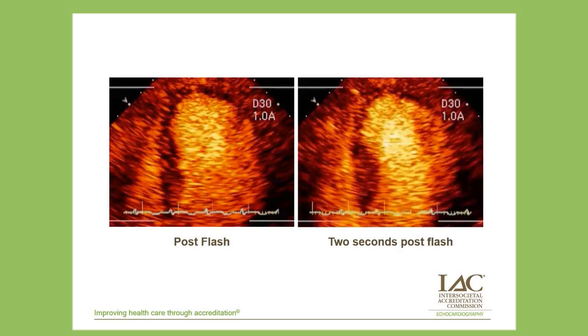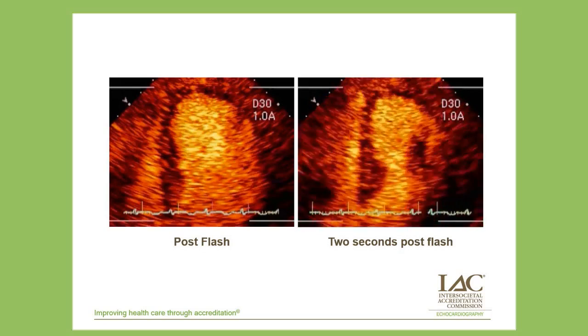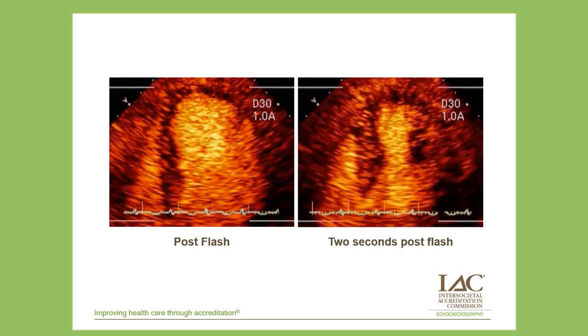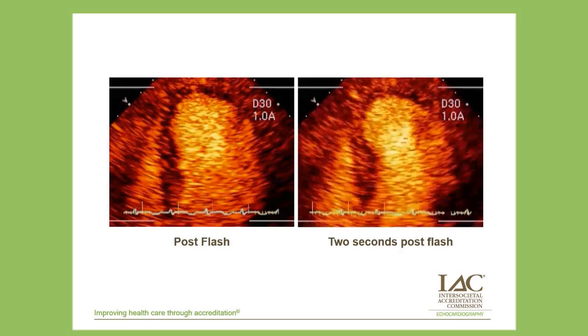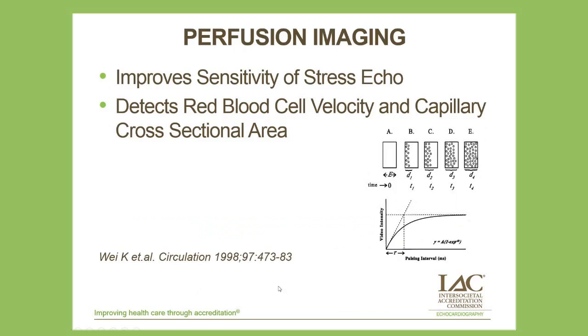So we've seen these subendocardial wall thickening abnormalities during dobutamine stress, and they've been very helpful for improving regional wall motion analysis during dobutamine stress when looking at that replenishment phase.